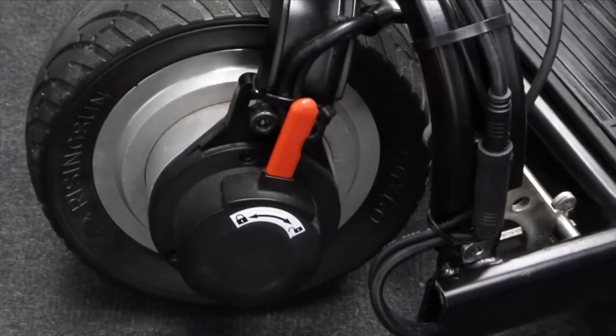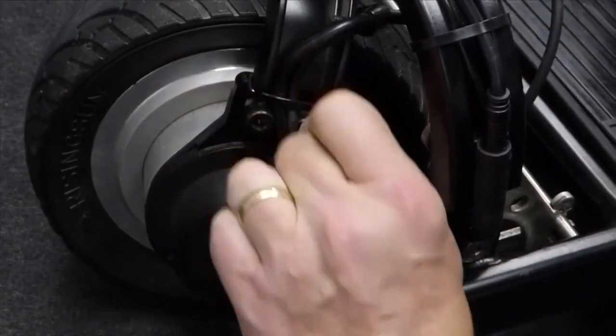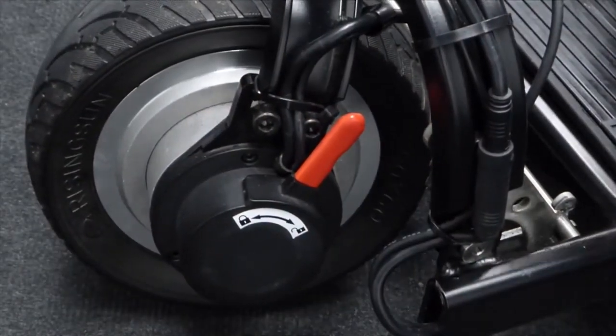Ensure the magnetic brake is in the locked position. In the unlocked position the scooter will be in freewheel mode and will sound a warning.